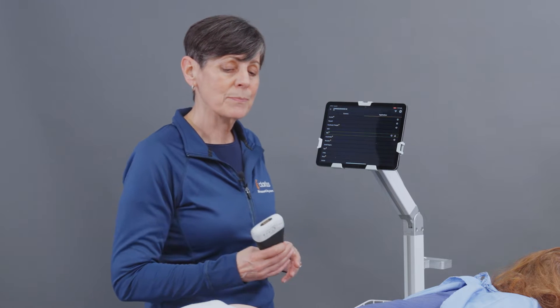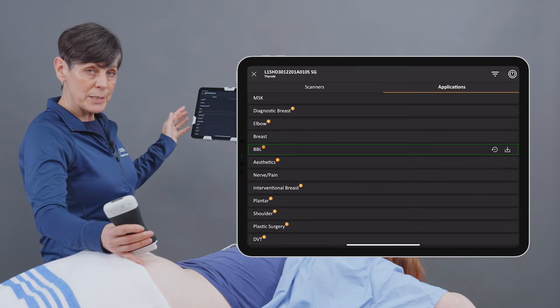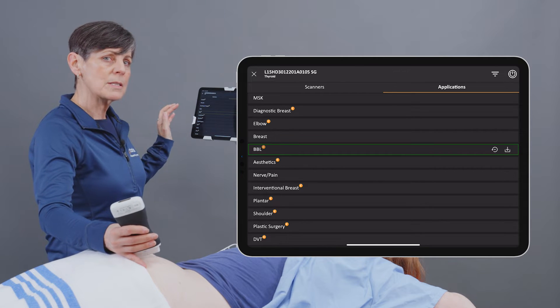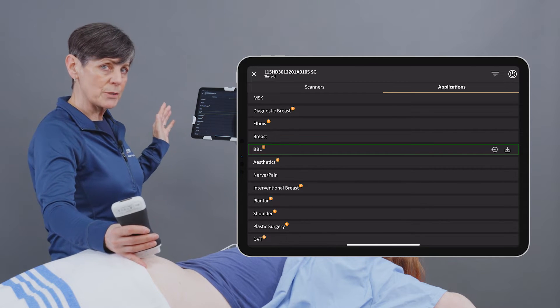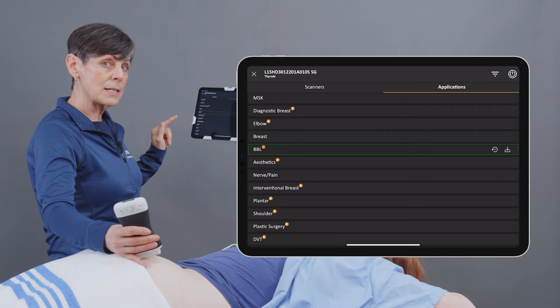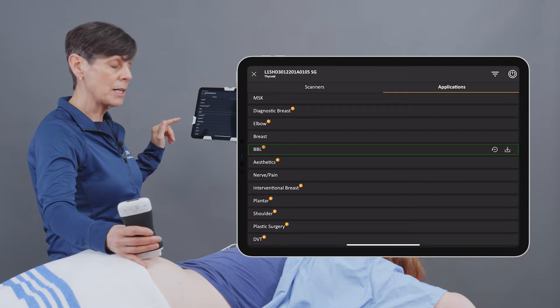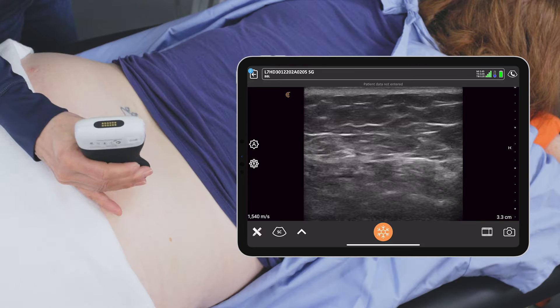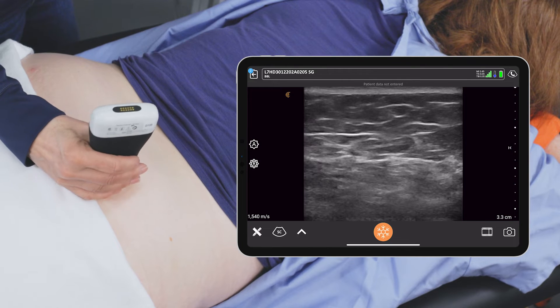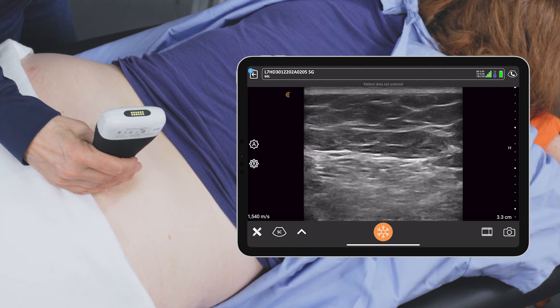Our AI-powered T-Mode helps to identify anatomical structures while you're scanning. So I'll show you how it works. You're going to select the preset that corresponds to the anatomy that you're scanning — in this case, we'll choose the BBL preset for plastic surgeons. And I'm going to place my scanner.